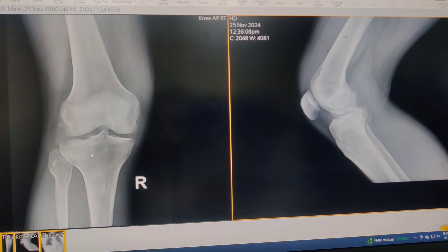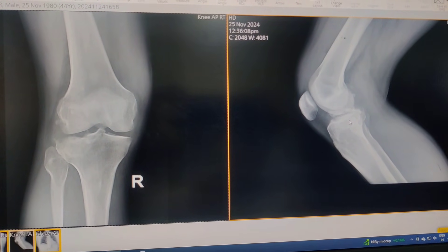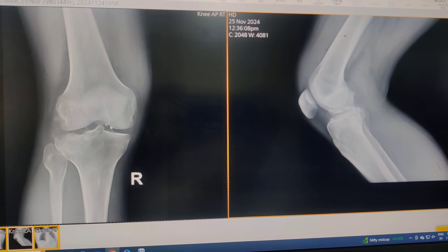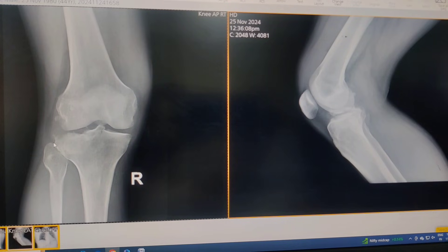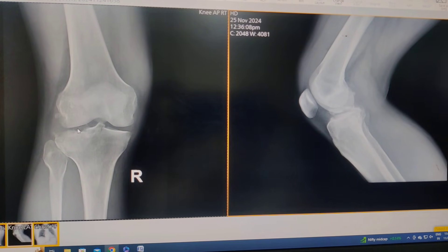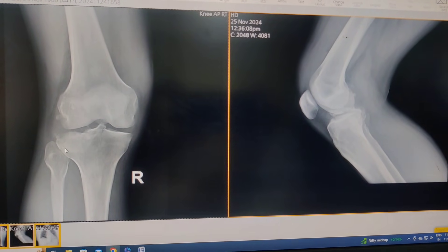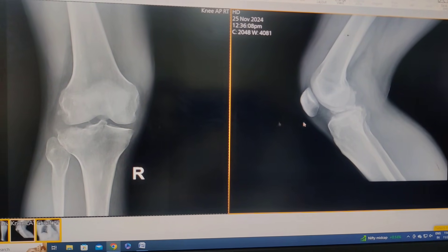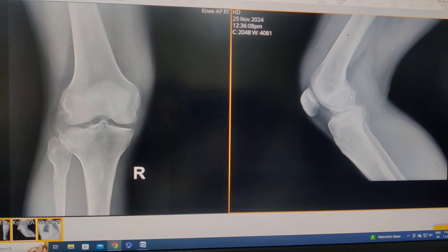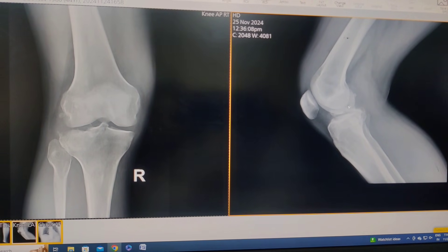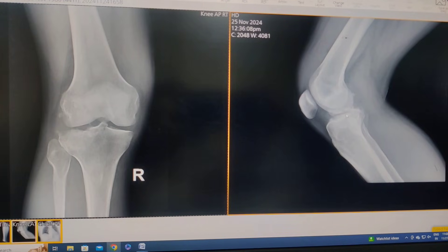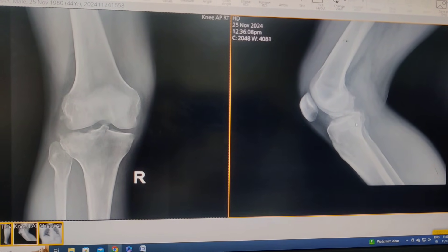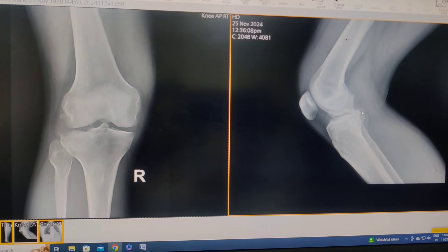This is the gentleman's AP and lateral X-ray. He is a 44-year-old gentleman who unfortunately fell from his bike. You can see something is not right — there is widening and probable involvement of the lateral articular surface. The lateral cortex looks reasonably okay, the medial side looks pretty good. But on the lateral view, something is not right, and there is injury to the tibial spines and something is not right in the back. Let me show you the CT scan.